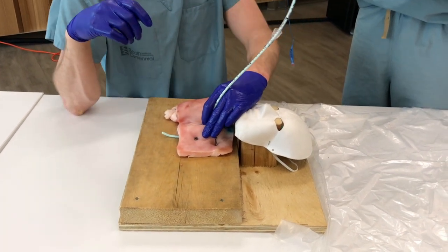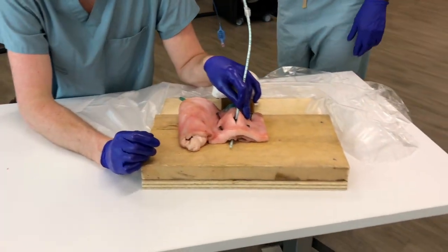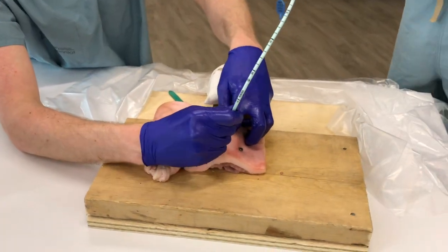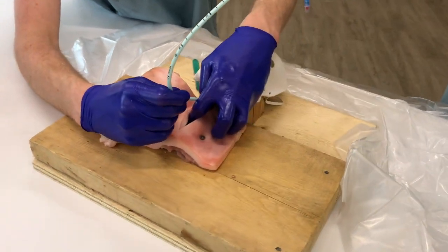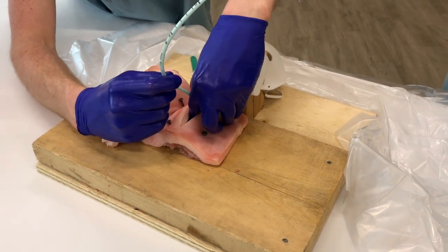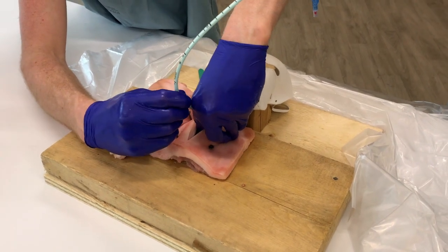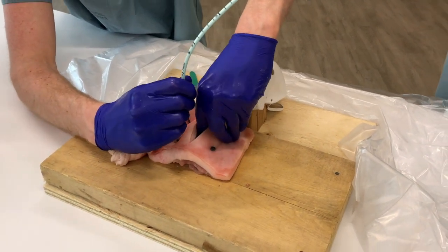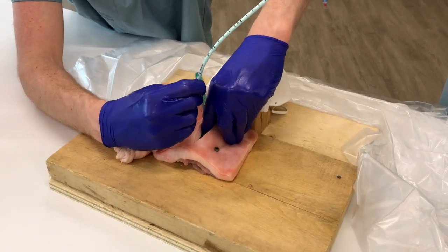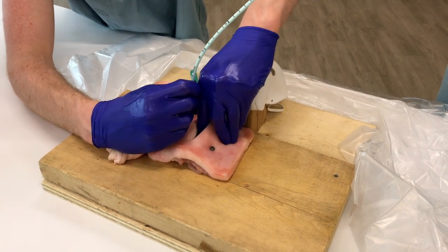A couple fine details here. You guys come around here. My finger's in here. Sometimes if I've got a lot of tissue, it can be a bit of a challenge to get that bougie and my finger into the space at the same time, right? So what I can do is use my thumb and pinch the bougie and use the thumb to sort of feed the bougie along my pad. I can withdraw my finger slightly. I'm still in the trachea, but making space for my finger and the bougie. Okay, and once I feel the bougie is in, I can remove my thumb again, pass the bougie slightly.